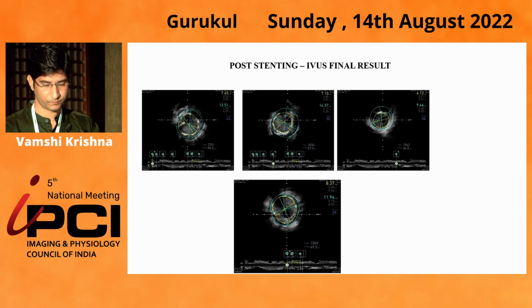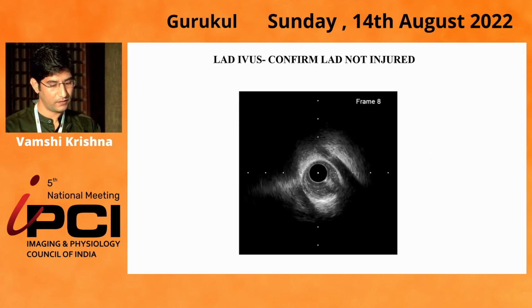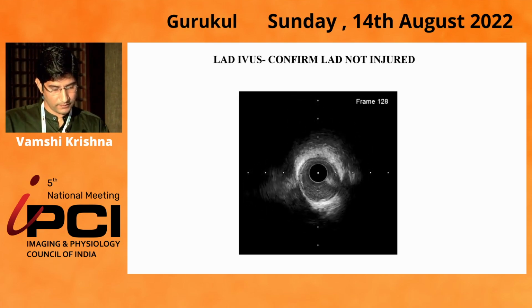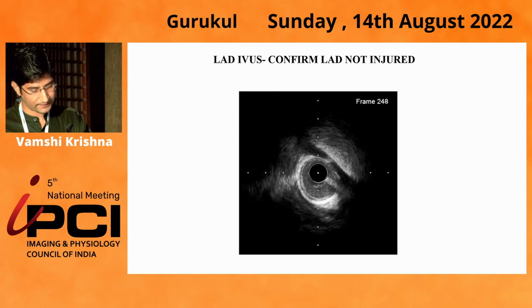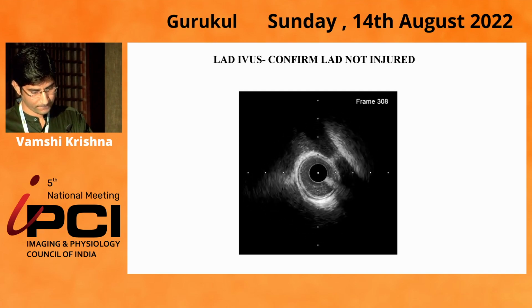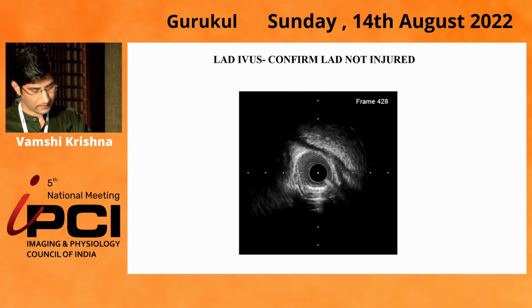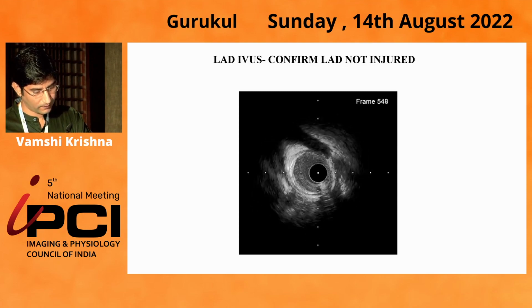Then after stenting, a final LAD IVUS was done to confirm that the LAD was not injured. This was the distal LAD showing no significant disease. There was a mild plaque and calcium at the 5 to 7 o'clock position.